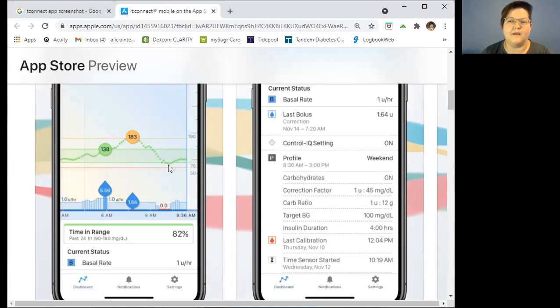It helps with one of the things that people complain about most with the system: everything I eat goes above 200. Well, that's probably because every time you eat, you have a downward blood sugar trend coming into that meal. When would I not want to add on that extra insulin? Well, if I've been really active, so I'm going to be extra insulin sensitive. Now the system is pulling down not so much because of my blood sugar action, but because of the exercise. So I don't want to throw extra insulin on top of a really sensitive time, or if I'm going to be active after this. So again, not blanket statements here, just some optimization pieces to think about.